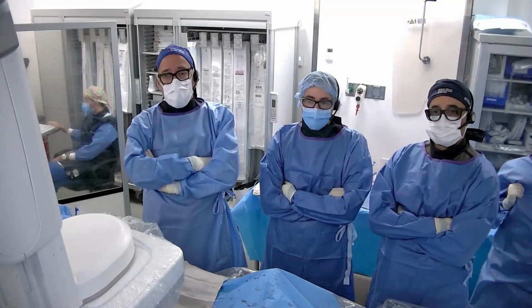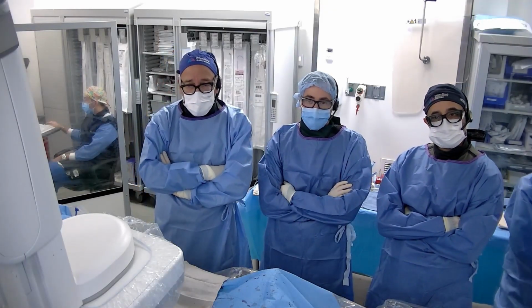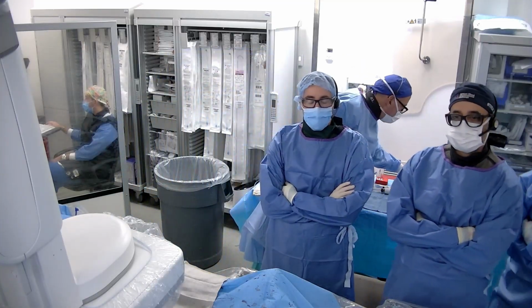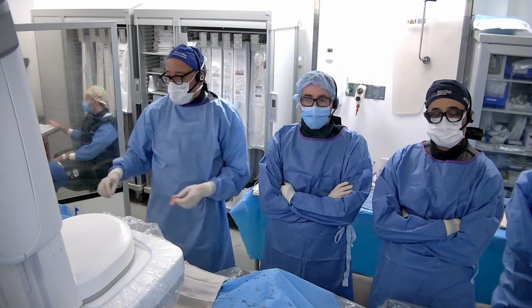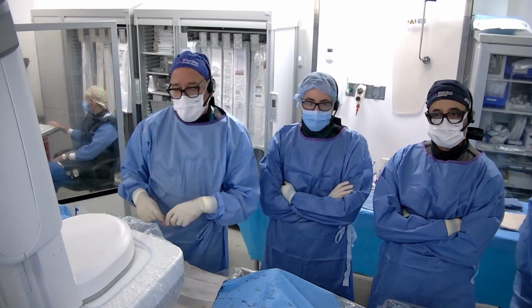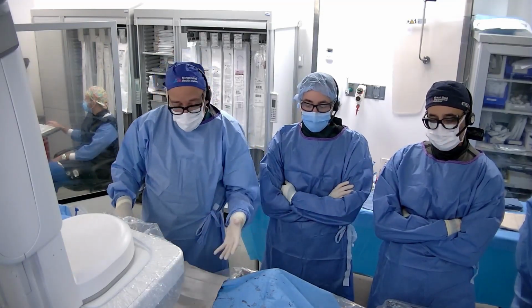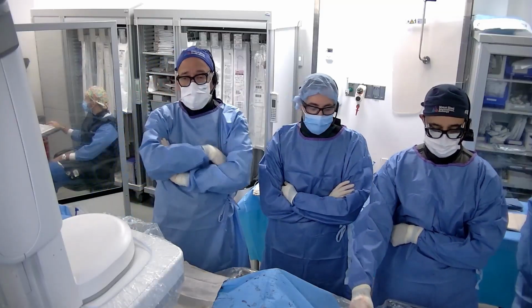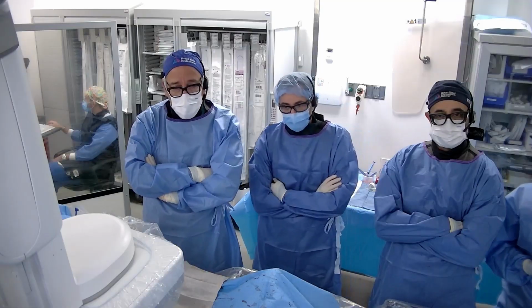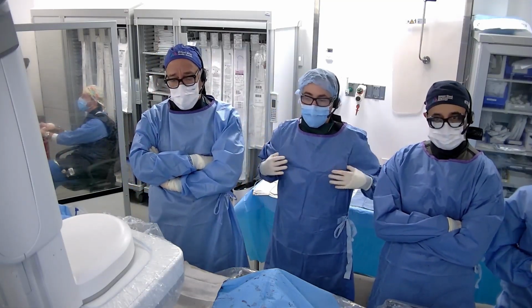I love the Benson trick. Also, the Newton wire works great as well. I would consider distal protection and maybe some kind of vessel prep, potentially laser, and then drug-coated angioplasty. Leanne? Yeah, I hate putting a filter down, but in this case, with how easily the wire passed, it makes me a little nervous. With the medial calcification, you could also consider IVL-based technology, and then some sort of drug-coated therapy. Zola? I agree with Leanne regarding vessel preparation. Probably IVL here and hopefully drug-coated therapy without having to leave anything behind unless needed.